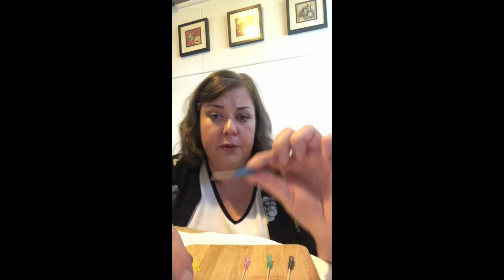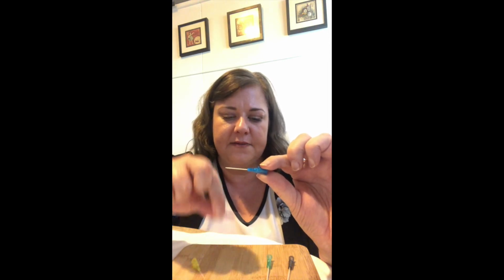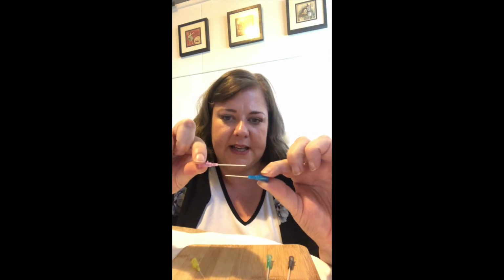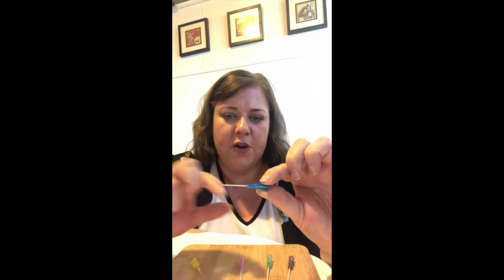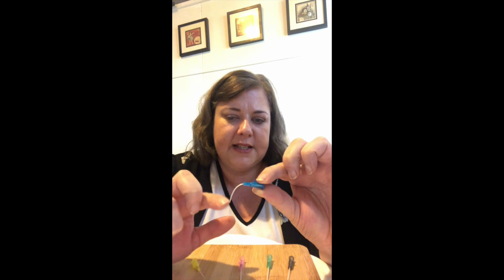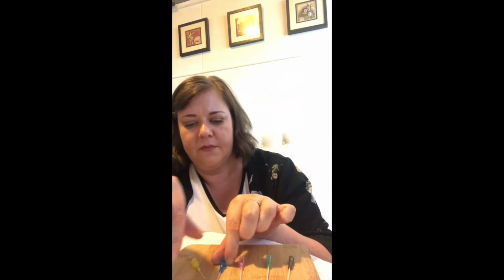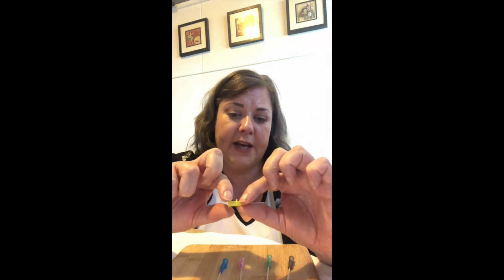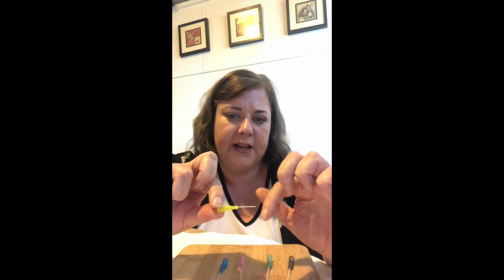Now when you move down to the 22 blue cannula, you can really start to see the size difference. You can see that it's shorter, and it's also starting to get a lot more fine, and you can see that it's super pliable. A lot like our smallest cannula, the 24 gauge yellow, which is short, thin, and super pliable.